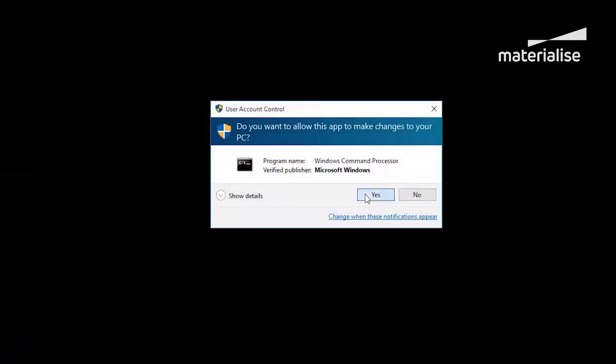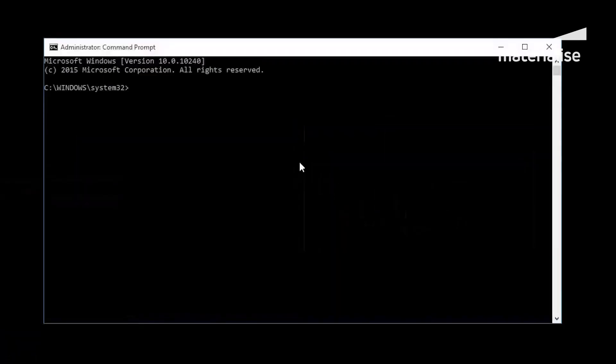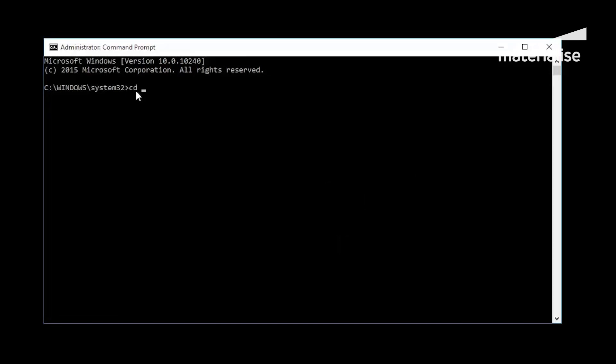To install the packages, I recommend that you direct the command prompt to the location where you just installed Python. With the cd command, followed by the directory, you can go to the Python installation location via the command line.